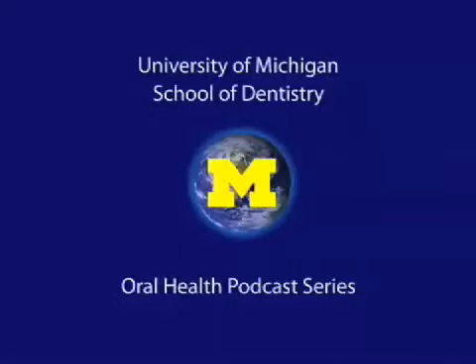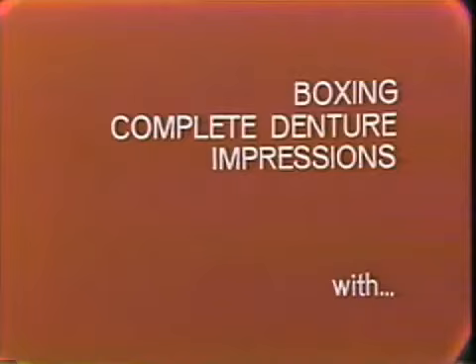Welcome to the University of Michigan Dentistry Podcast Series, promoting oral health care worldwide. In this exercise, I'm going to show you how to box both maxillary and mandibular impressions with pumice and impression plaster.